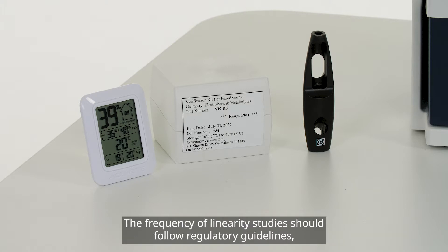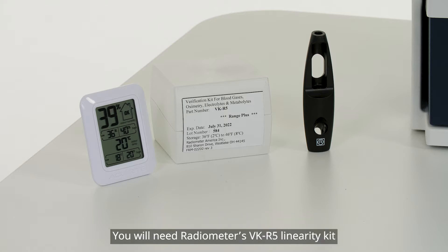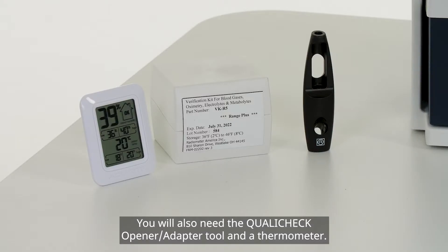The frequency of linearity studies should follow regulatory guidelines, most commonly every six months and after every major maintenance. You will need Radiometer's VK-R5 linearity kit and Radiometer's Microsoft Excel linearity form template to complete the linearity studies. You will also need the QualiCheck opener adapter tool and a thermometer.